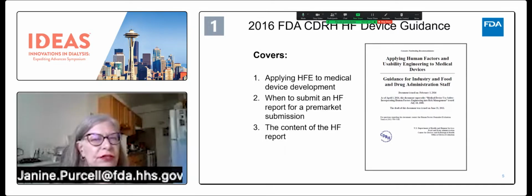So if you've only been concerned with complying with IEC 62366, IEC 62366-1, you may have set the bar not to the degree of specificity that we'll be looking for in your human factors validation data when you come with your submissions. This guidance also talks about when to submit a human factors report.